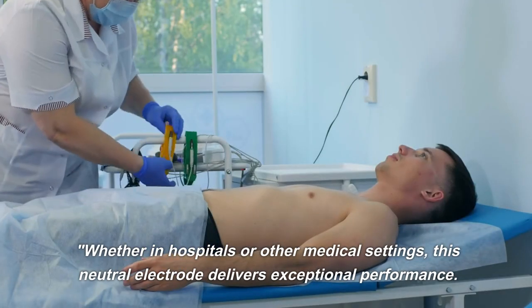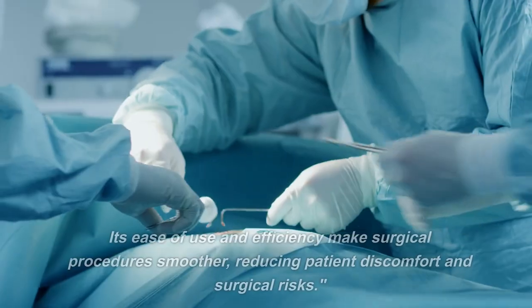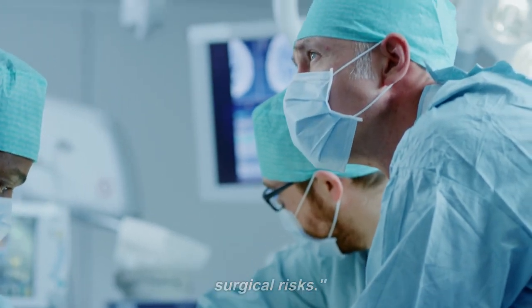Whether in hospitals or other medical settings, this neutral electrode delivers exceptional performance. Its ease of use and efficiency makes surgical procedures smoother, reducing patient discomfort and surgical risks.